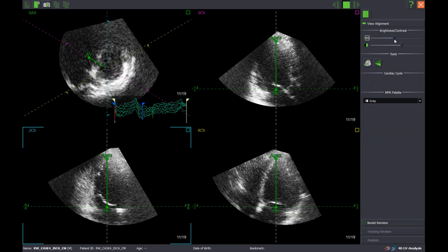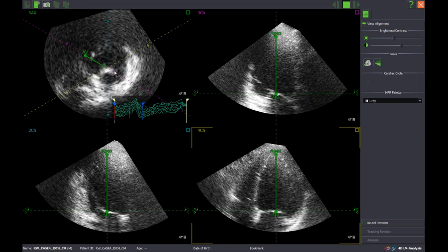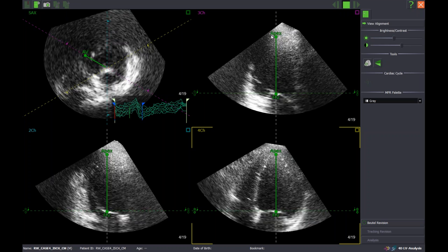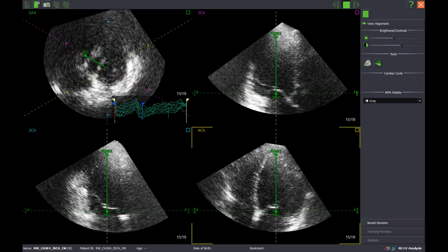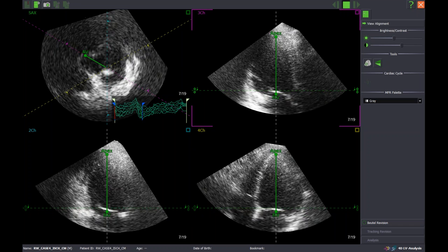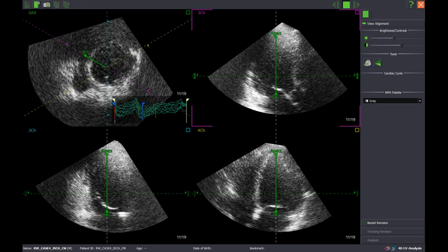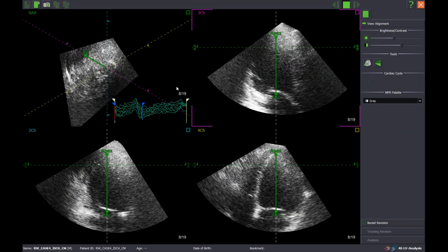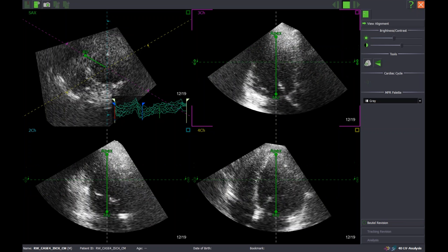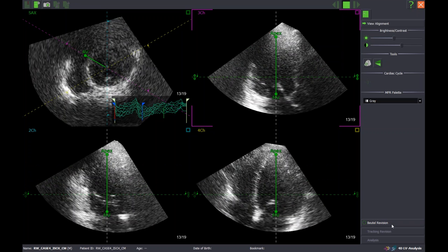If what you get works, then great — and if it doesn't, then you learn something. There's going to be a little area here we may not see as well, but remember: these are 2D thin cut planes of a 3D data set, so the tracking is going to see a lot more than what you see here. You can get a little too hung up on quality until you've actually run it and see how it looks. We can take this up into the mid ventricle, scan through the whole data set, and you can see the apex moving and then the mid section. It's not a great data set, no contrast, but I'm going to give it a shot. I've got my mitral here in the middle of the annulus and all three views checked, including the three-chamber, so we'll do our revision.